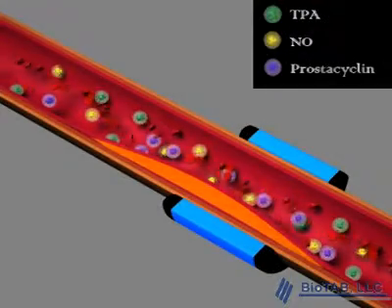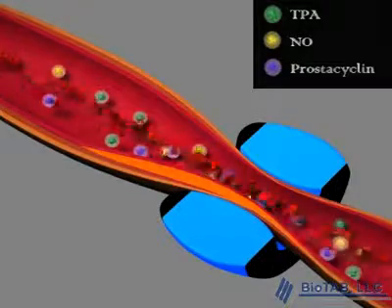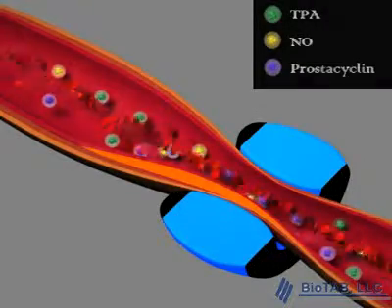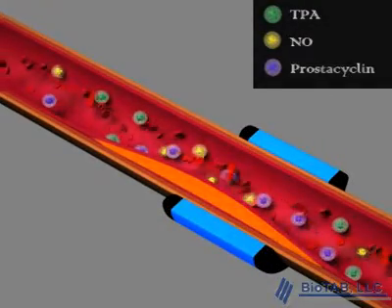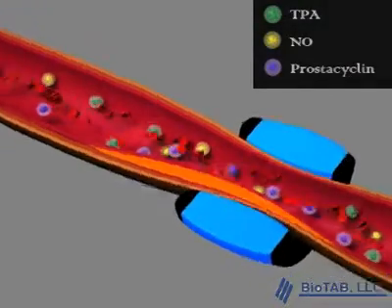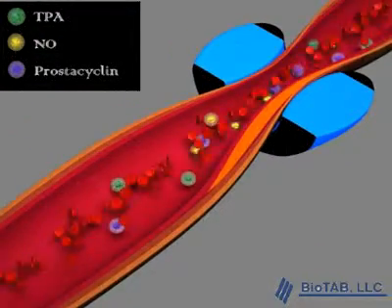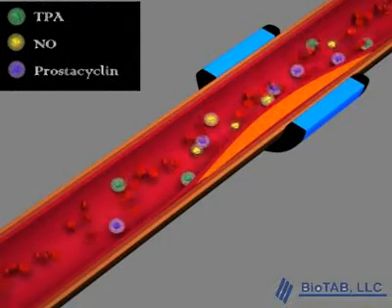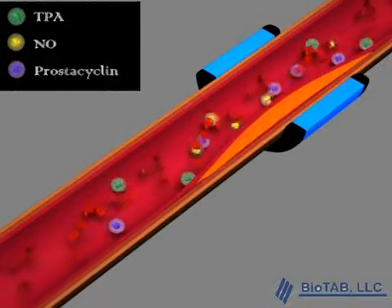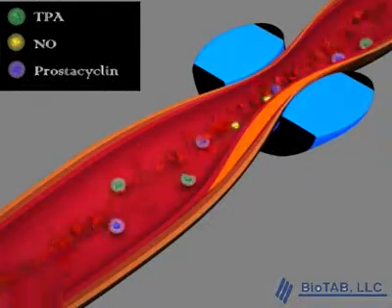In the deep veins, there is a slow, steady flow of blood within its lumen prior to compression. When compression is applied, this sudden pressure gradient at the pressure zone accelerates the blood forward with a subsequent collapse of the lumen at the compression zone, effectively facilitating venous emptying and preventing stasis. The accelerated blood moves forward and causes distension of the compliant lumen. The distension exerts up to 48% strain on the endothelial cells.